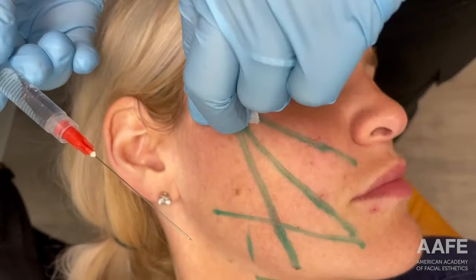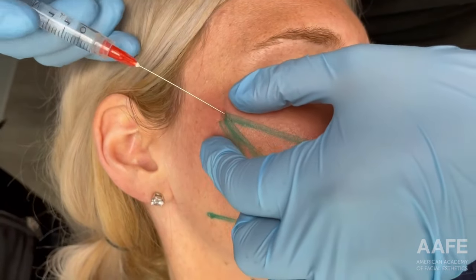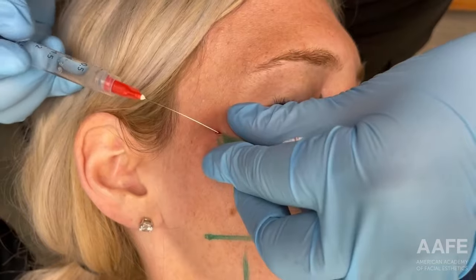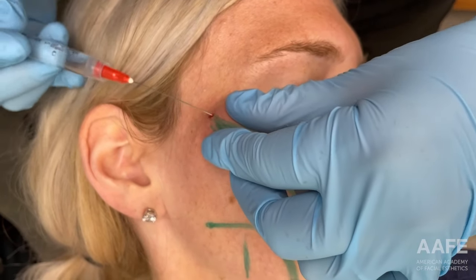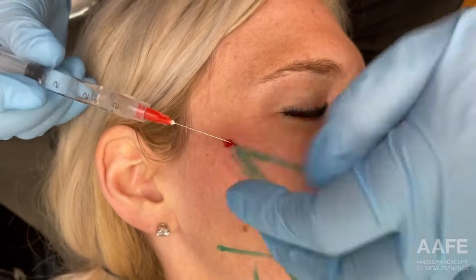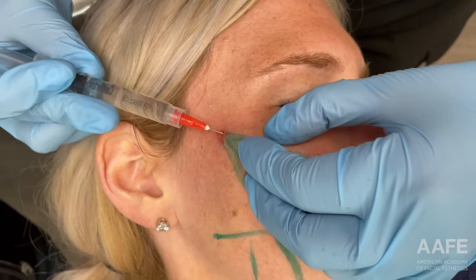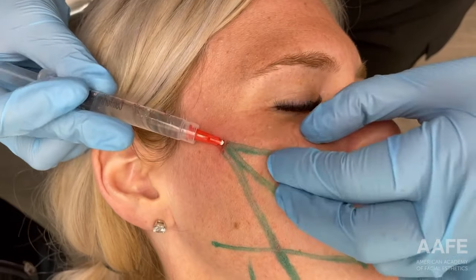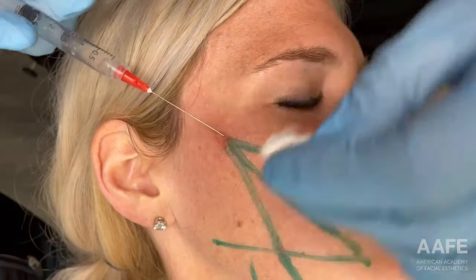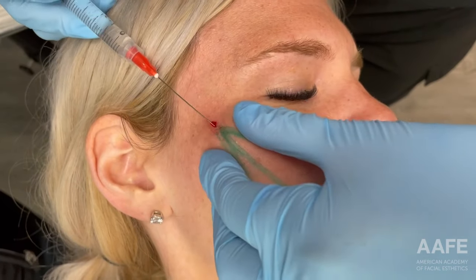Now I'm going to use my cannula to numb my individual vectors, going back in that same entry point. This is a blunt tip cannula, which is why we have to first go in with the pilot needle. We're administering a little bit of lidocaine in these vectors so that when we come back with our threads, she doesn't feel too much.